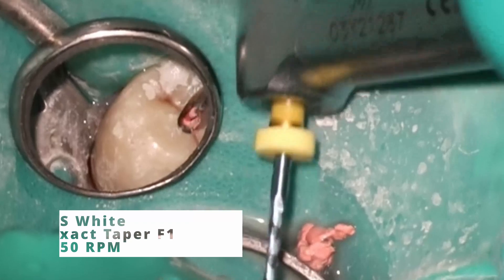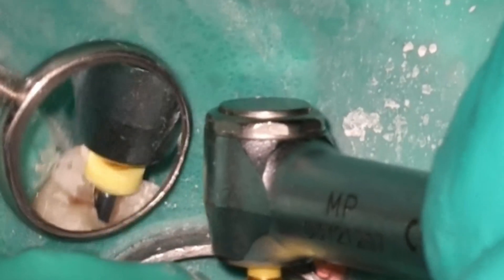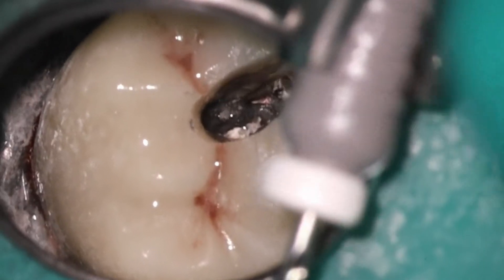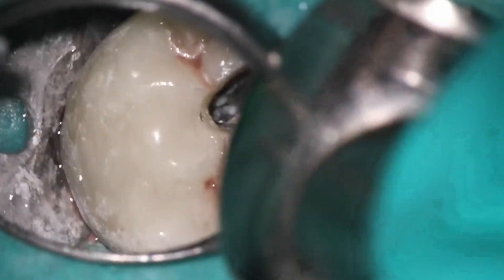Moving over to the two buccals — as I showed in the cone beam, I'm going to address both the MB1 and the distal buccal, but we will leave the palatal alone. The F1 is such a nice file for this sort of thing. Spin it fast at 550; it heats up and pulls out that gutta percha. When it completely covers the flutes of the file, you do want to remove it at that point. This is a lot of work — just slowly troughing down. One of the residents asked how far I go, and I was always taught you want to go about three millimeters, give or take. I'll switch over to the EG3 here just to be a little bit more conservative. You can see it's slightly larger — 014 instead of 012.